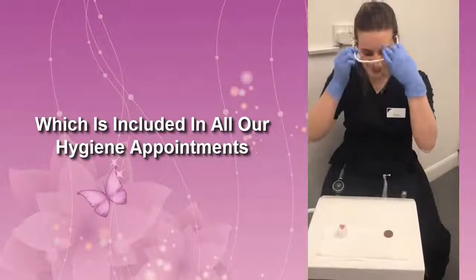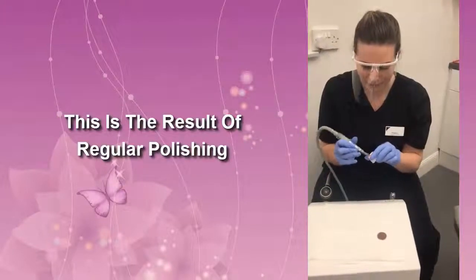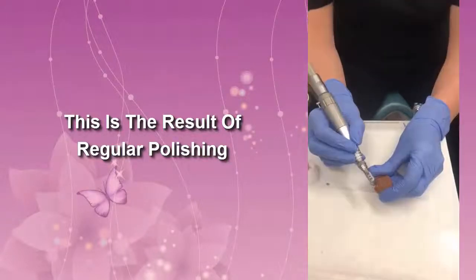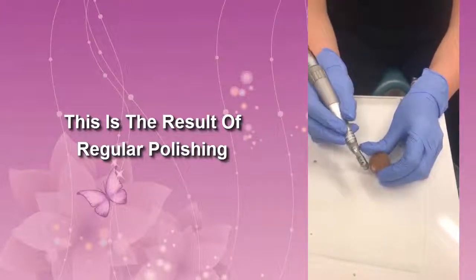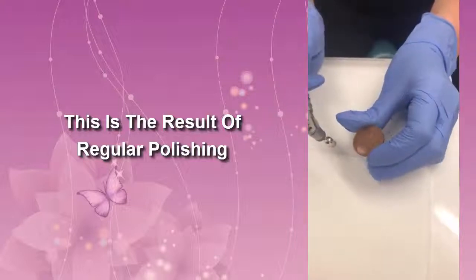So I'm going to put this on first of all — it's a bit messy. First I'll show you the results that we get with our normal polish on this lovely dirty 2p. As you can see it does take some of it off, but it is a bit harder to get in between the teeth, especially those coffee and tea stains.